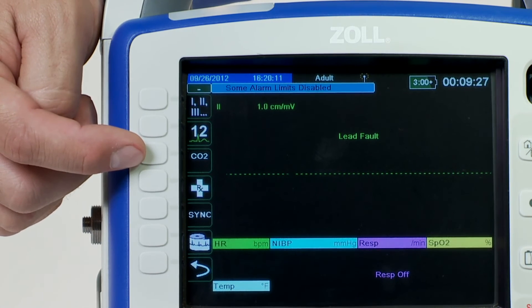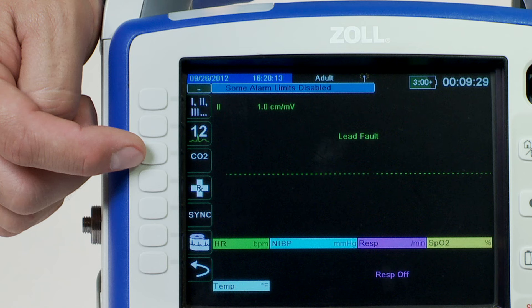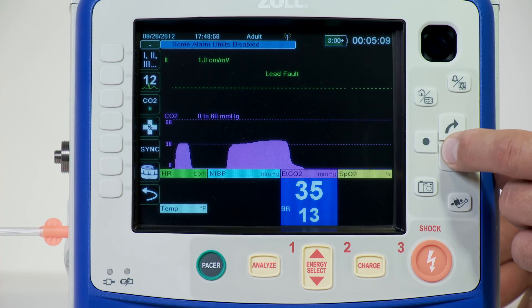Press the CO2 key to activate or deactivate capnography. As soon as capnography is activated, the capnographical waveform automatically appears on the screen. Respirations, which are measured through changes in thoracic impedance, automatically transition from impedance pneumography to capnography measurement. The capnogram waveform is inserted automatically on the waveform display window.